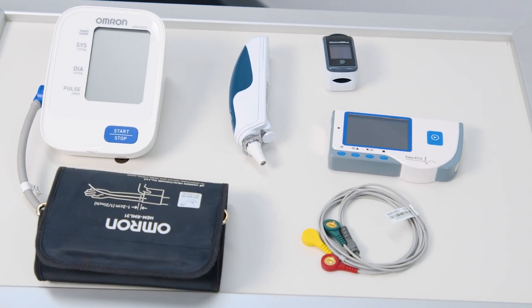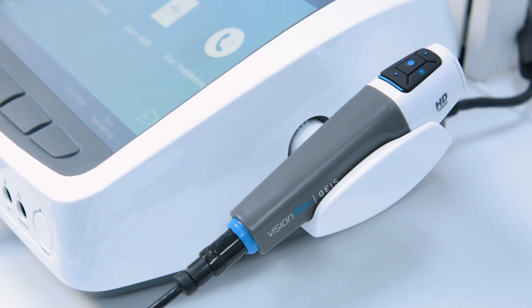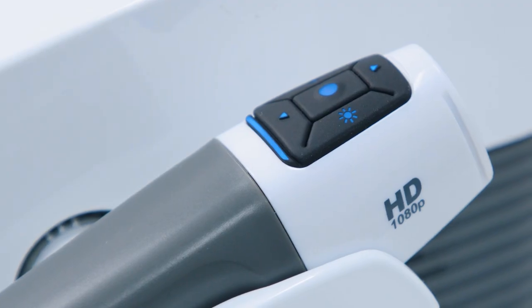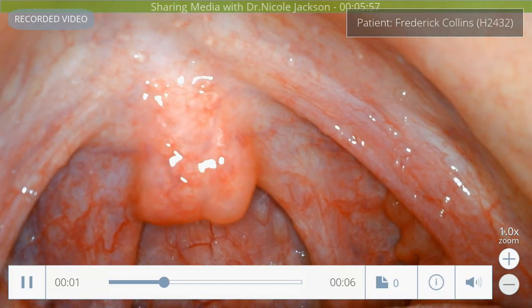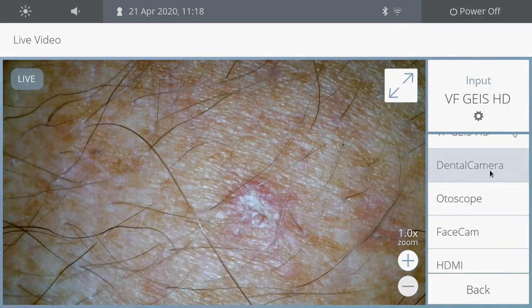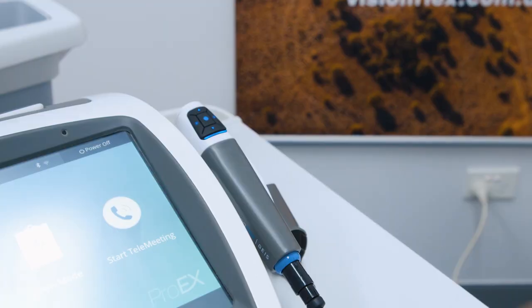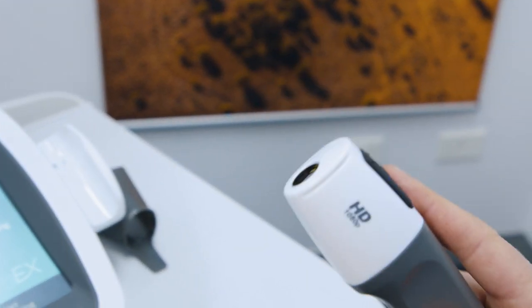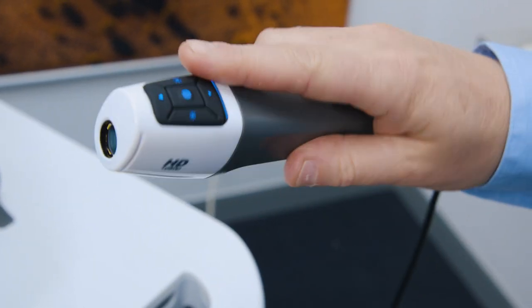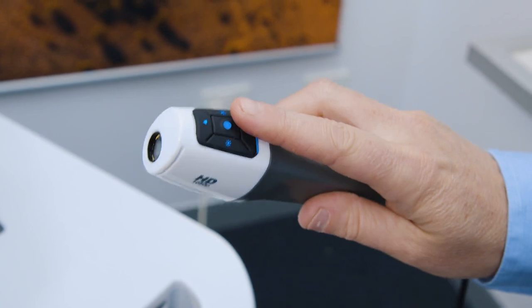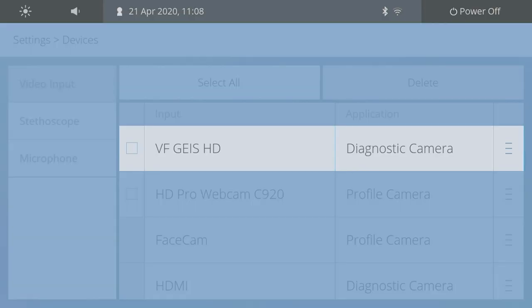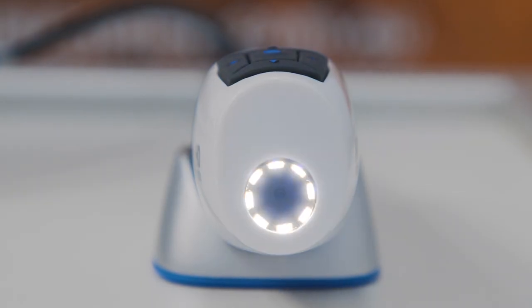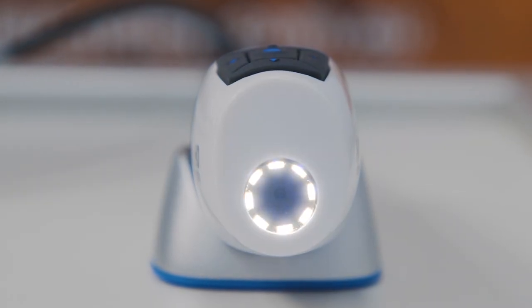In live video mode, for example, you can connect the GEIS general exam camera, which is used for oral examinations, burns, scars, ulcers, and general wound management. The high-definition GEIS exam camera can focus from approximately 45mm out to infinity.